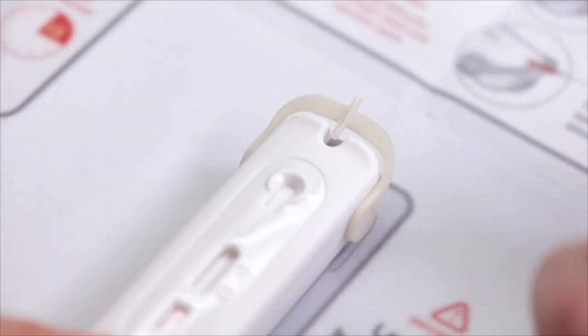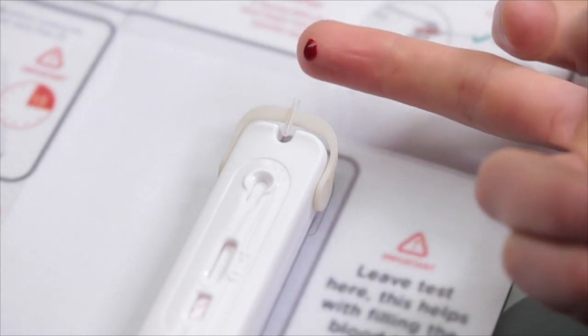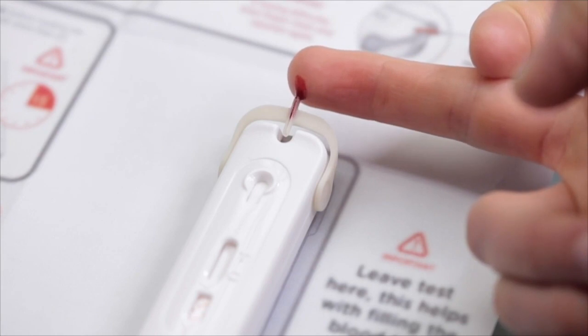The most important thing to remember from this video is that when you are filling the blood tube, keep the device on the table the entire time. Hold your finger in a downward position, gently touch the blood to the tip of the tube, and avoid touching the tube with your skin.